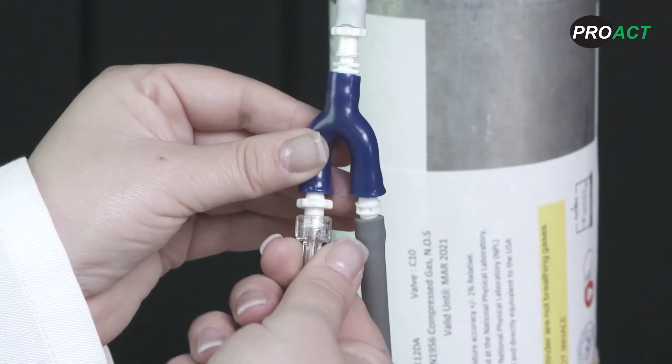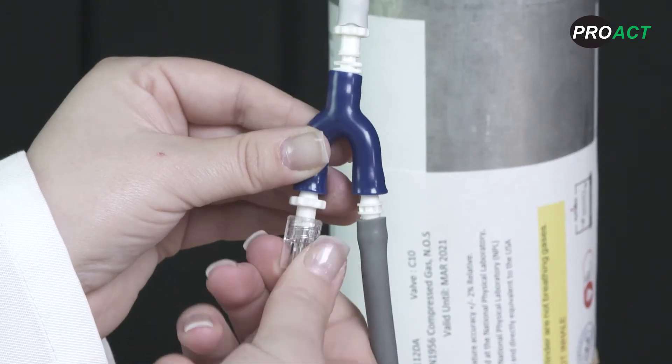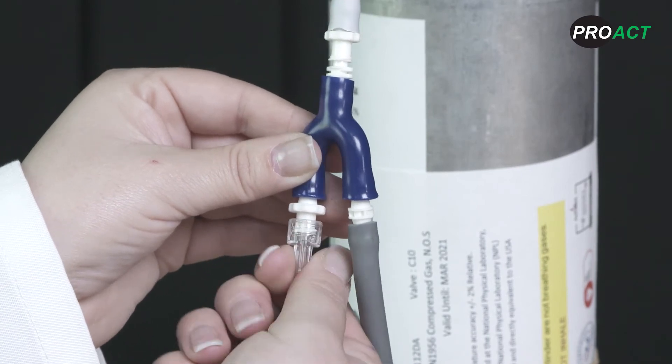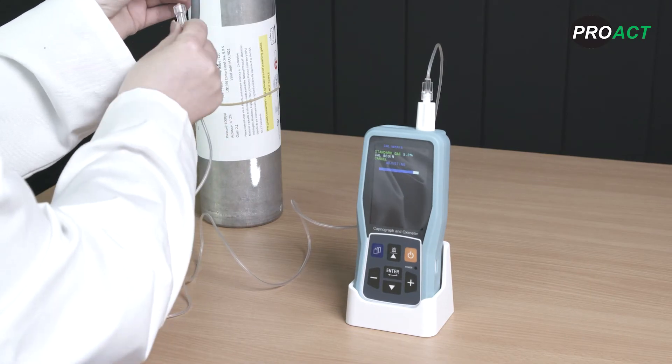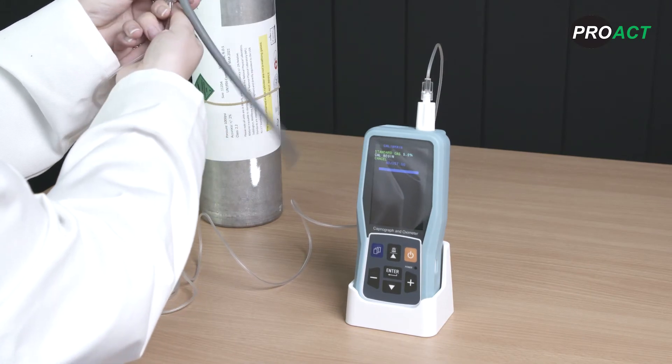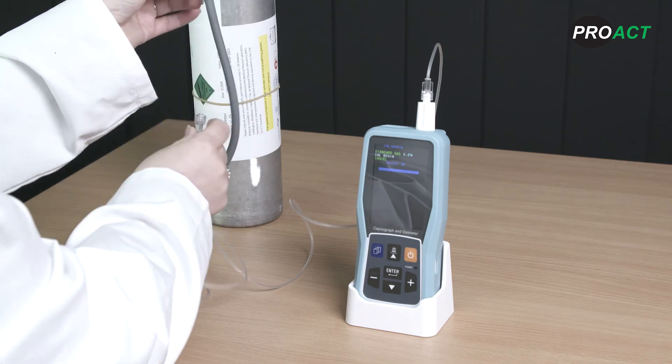Turn your 5% CO2 gas on full at the flow regulator. As the white line changes to blue, mimic the patient breathing with your gas and luer line connector as shown, with two seconds on and two seconds off. Ensure that the luer line is fully screwed in for two seconds on and that it is fully unscrewed and sampling room air when off.